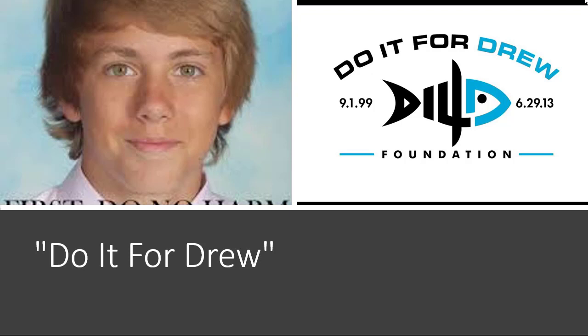By 11:23, 3 minutes later, his SATs dropped to 40%. So at this point, that should have been a huge red flag. Okay? For whatever reason, they didn't necessarily register this. And by 11:25, his SATs were unreadable. His pulse rate had dropped, severely bradycardic in the 30s, and there was no palpable pulse.